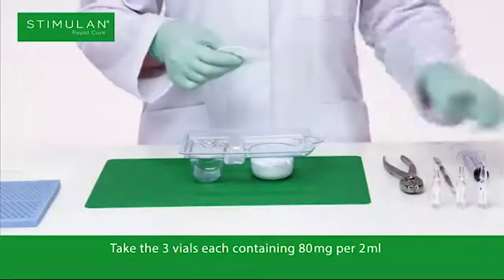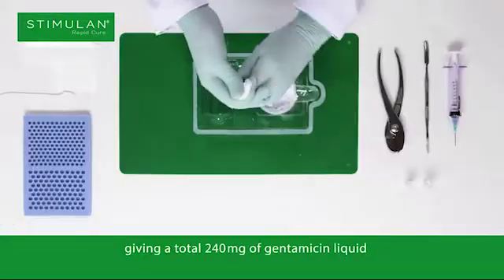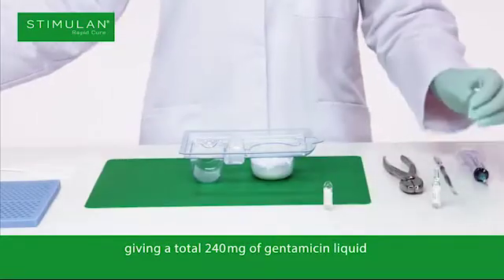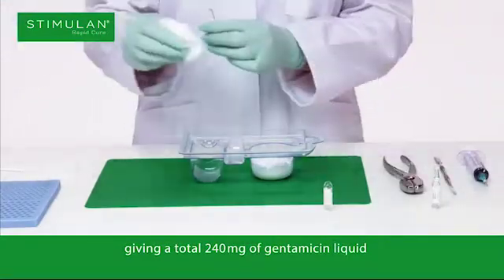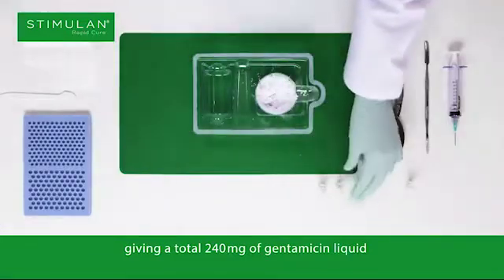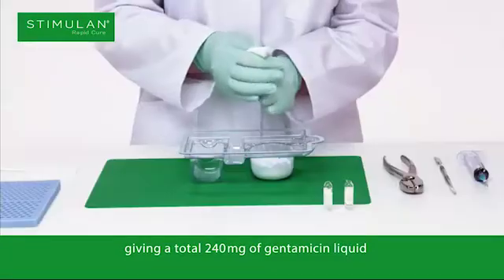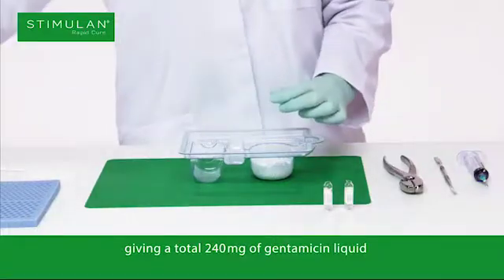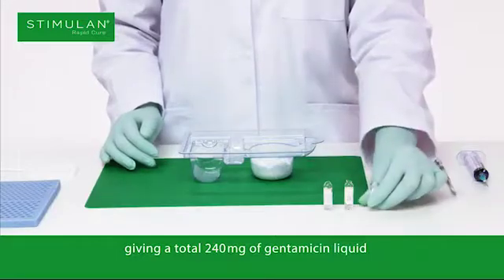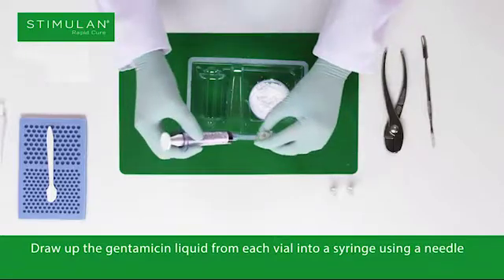Take the three vials, each containing 80mg per 2ml, giving a total 240mg of gentamicin liquid. Draw up the gentamicin liquid from each vial into a syringe using a needle.